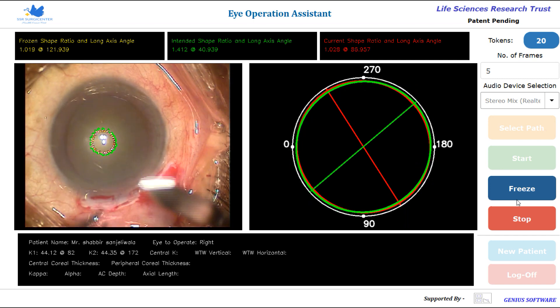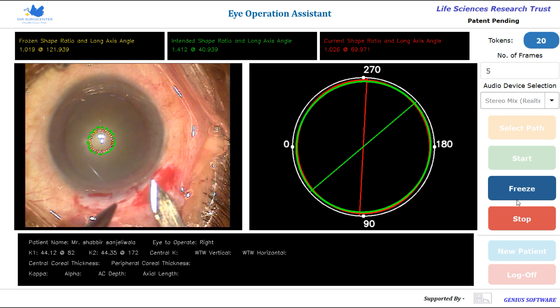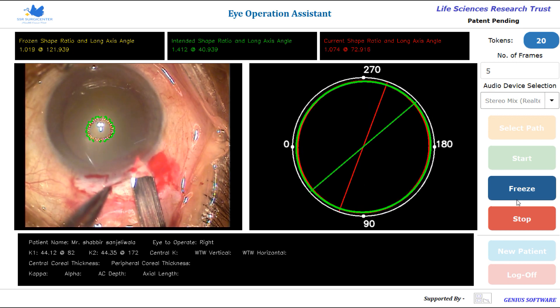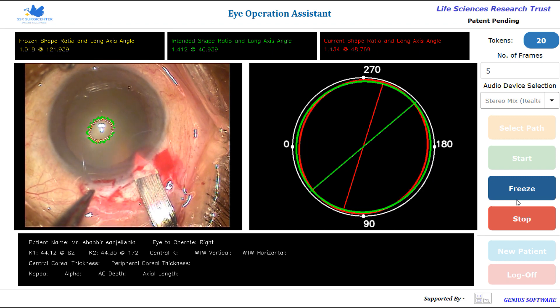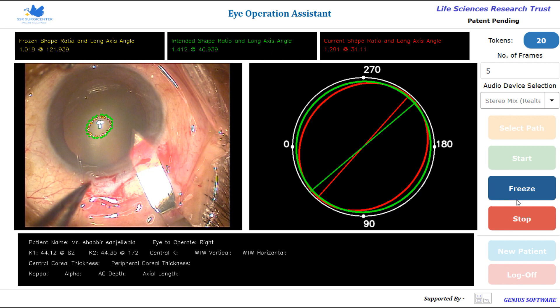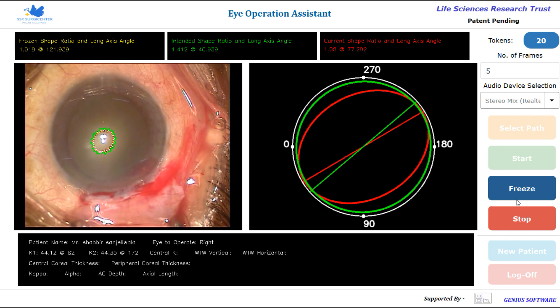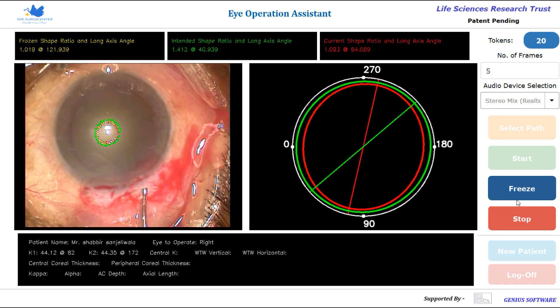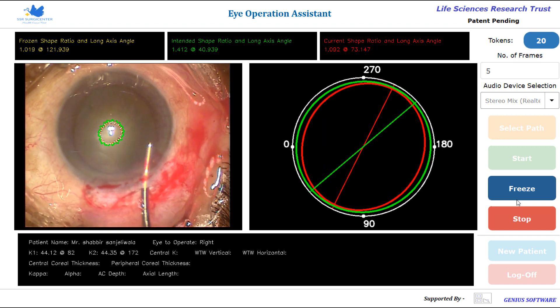Software readings cycle: Intended shape 1.41 at 40, with current measurements reading 1.03 at 86, 1.03 at 69, 1.07 at 72, 1.13 at 48. Next cycle: Intended shape 1.41 at 40, current reading 1.29 at 31, 1.08 at 77, 1.09 at 67, 1.09 at 64, 1.09 at 73.